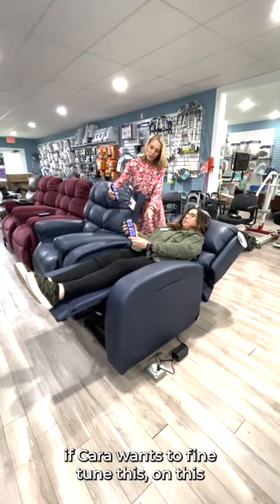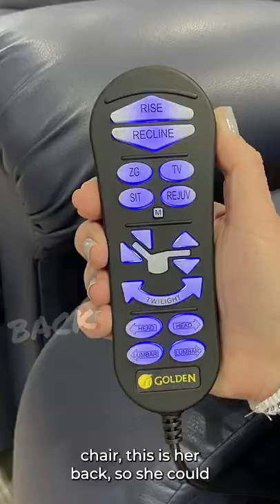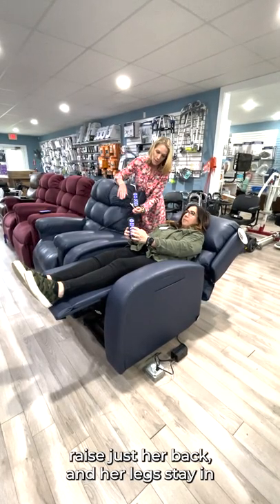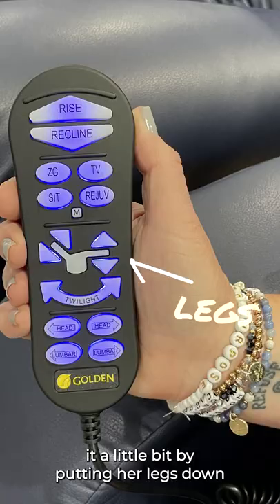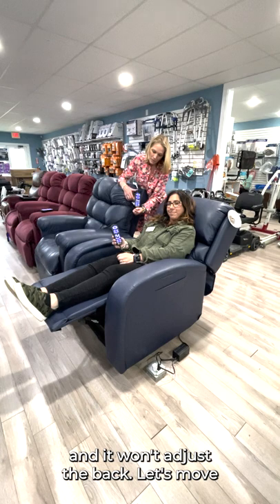Now, if Kara wants to fine-tune this, on this remote there's an icon which looks like a chair — this is her back. So she could raise just her back and her legs stay in this position. She could also fine-tune it a little bit by putting her legs down, and it won't adjust the back.